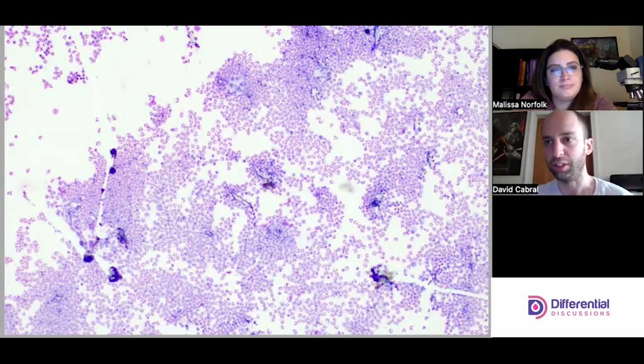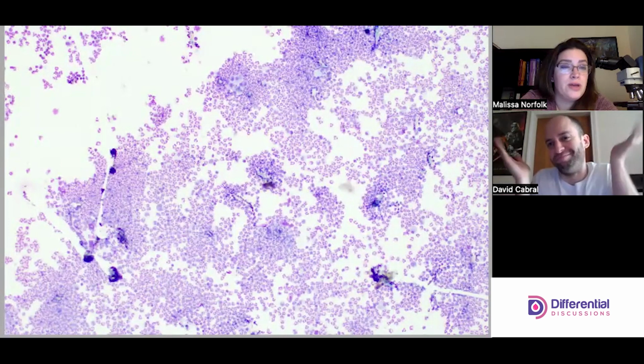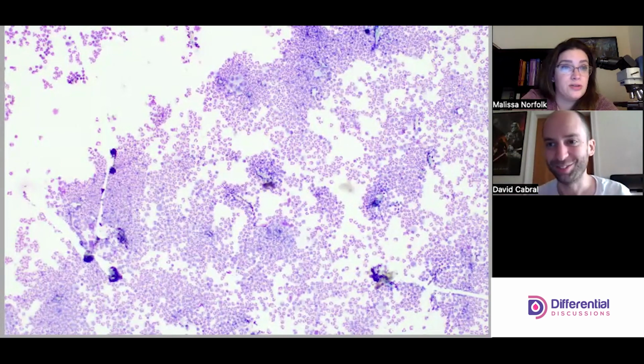Pleural effusions and pleural fluids are usually much more consequential. With synovial fluid, someone might have arthritis, it could be an infection, it could be crystals, but you're not looking for malignancy. So it's just slightly different. The stakes are lower, sort of.